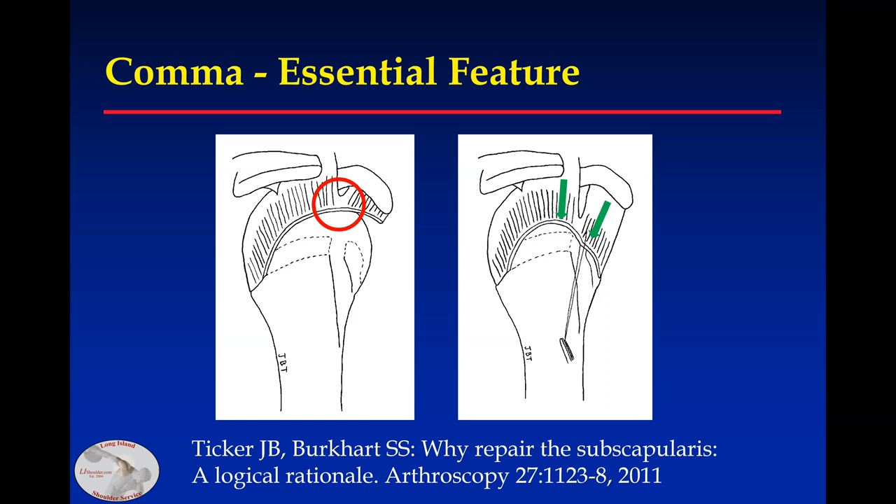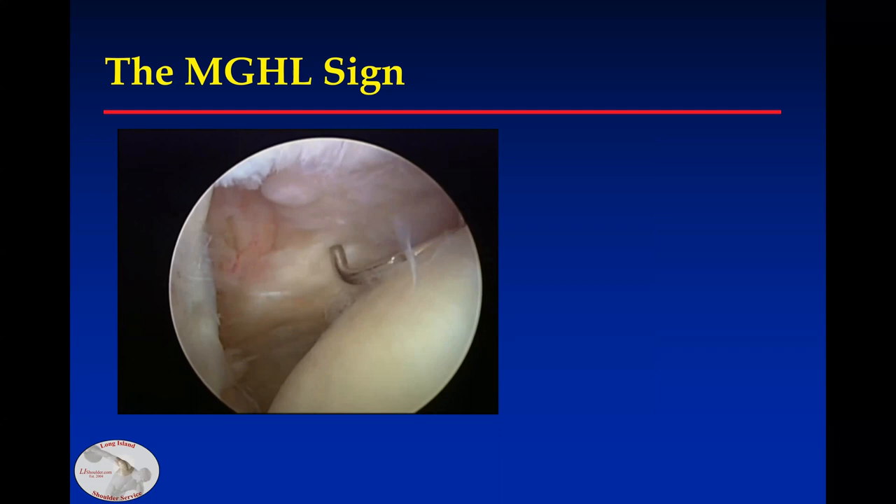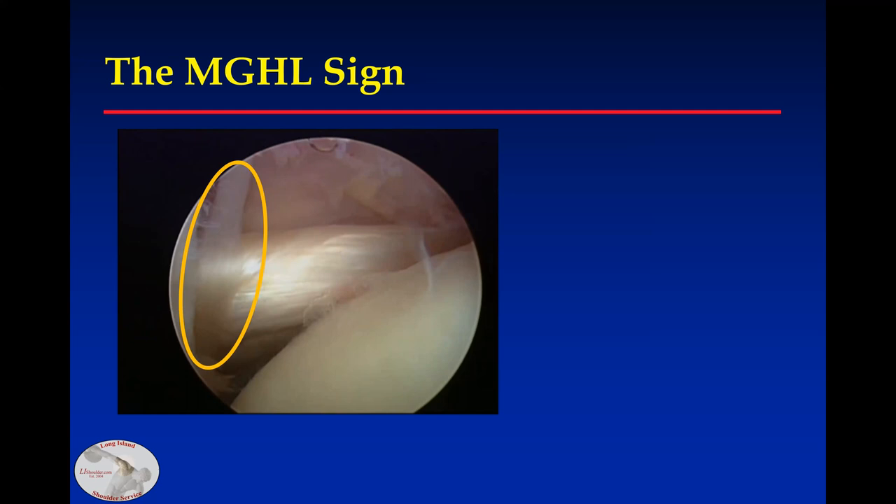I also look for the middle glenohumeral ligament. Here's the comma tissue — retract on it and bring the tendon laterally. When you see the middle glenohumeral ligament in its normal position at or lateral to the glenoid, that'll help guide you with how much you need to bring it laterally to the repair. In this case, that's in external rotation.